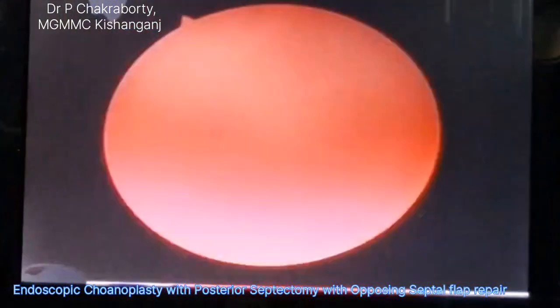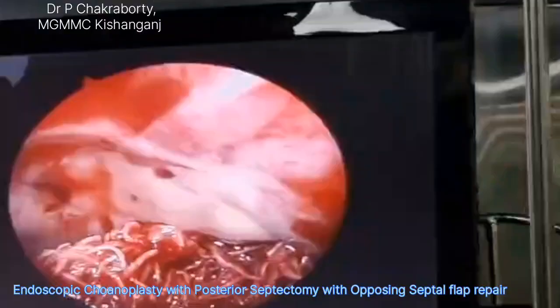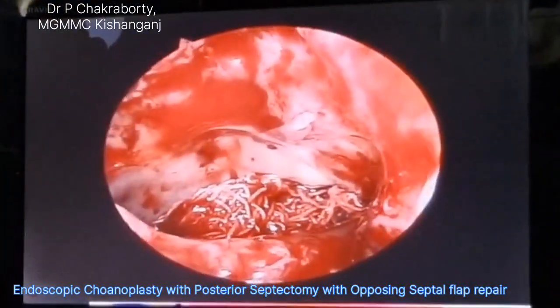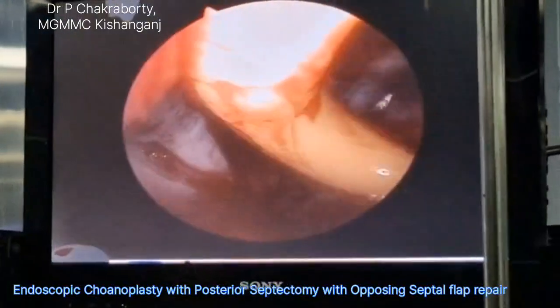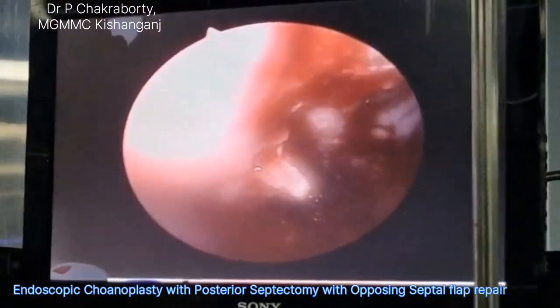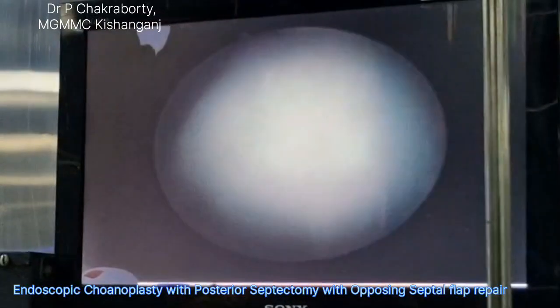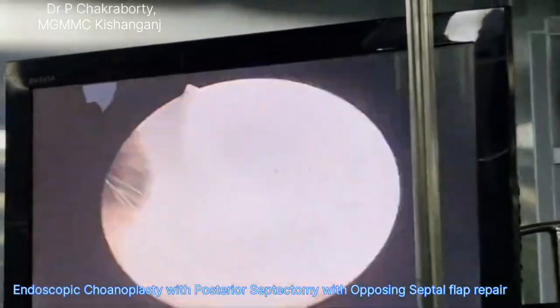Now most of the work is done. I could not show the part where we are removing the bones, so we removed the bony part of the choanal atresia using chisel, and also we did use some Kerrison bone punch to remove the bony overgrowths. We also removed the rostrum of the sphenoid using a chisel.